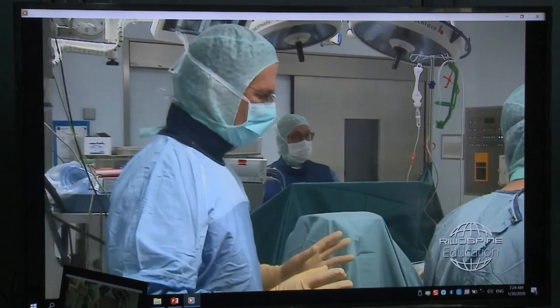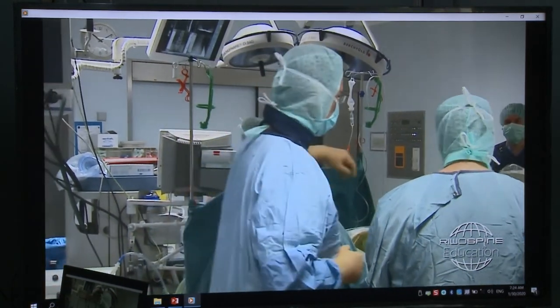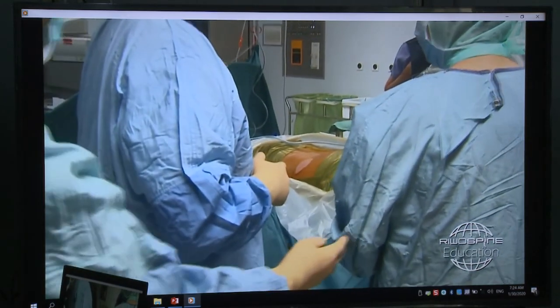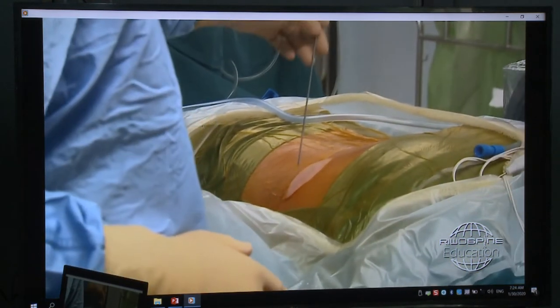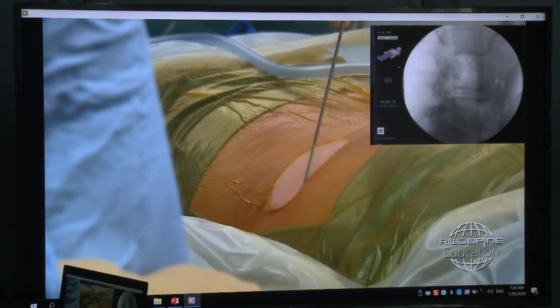So the first thing we start with is the planning of the approach, and we start in the lateral C-arm position. Find the lines now. Left side is cranial, there's the head, right side are the feet. So we start to mark our entry point, L4-5.